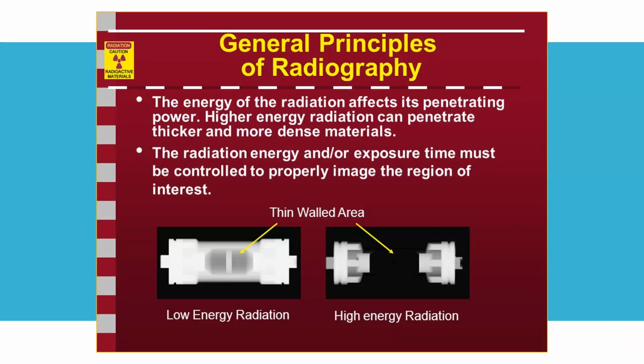But at the end of the day, it's, again, like we talked about thermography, if the computer is looking at it, it's purely looking at the numbers. Right? If you've got an electric detector, it's looking at the strength of the field being absorbed at each sensor point. And then it can put colors, black, white, some shade of gray in between, or it can even go into using a color scale. But when it was film, it either turned dark black or white. So same object, higher or lower.